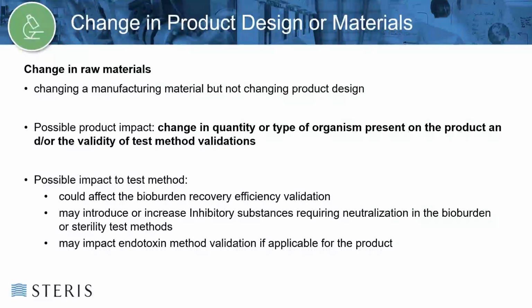Possible impact to test method validations is that it could impact the bioburden recovery efficiency. They may introduce or increase inhibitory substances requiring neutralization in the bioburden and sterility test methods, and they may impact endotoxin method validations if applicable to the product.